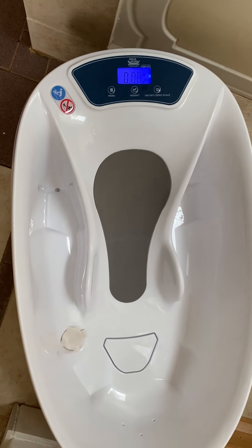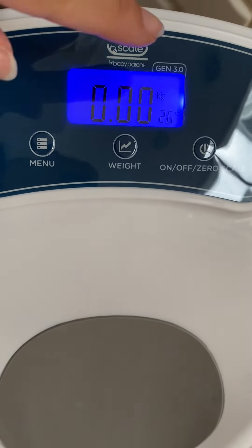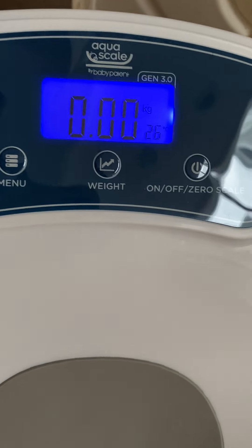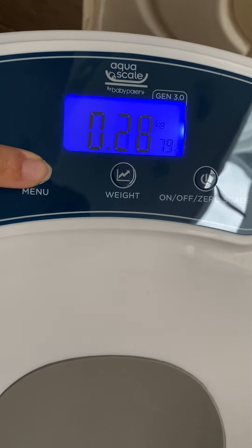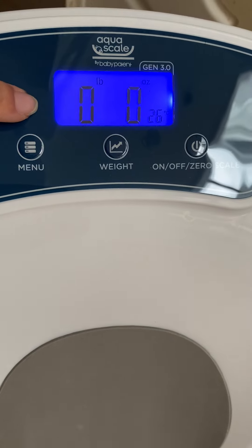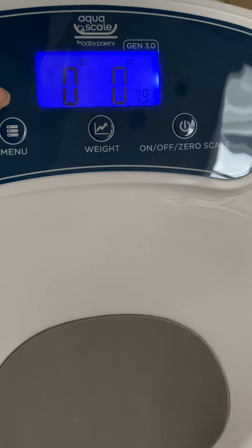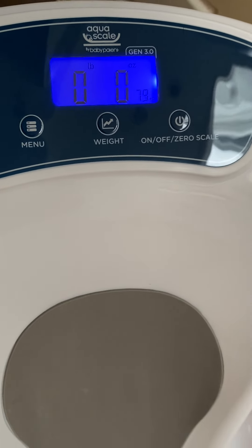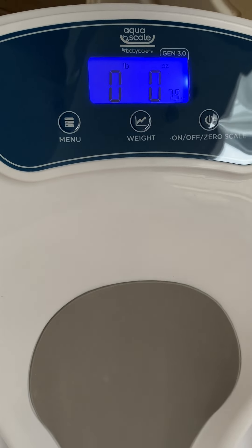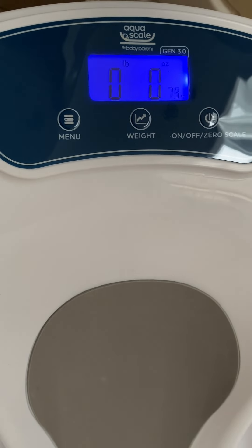You have several measurement functions: kilograms and Celsius, which I prefer since I grew up in Japan with metric, then kilograms and Fahrenheit, and press again for pounds and Fahrenheit — which is probably what most US people use. So even if you are an international family, you can switch through the menu and everybody knows exactly how heavy the baby is, which is really great.